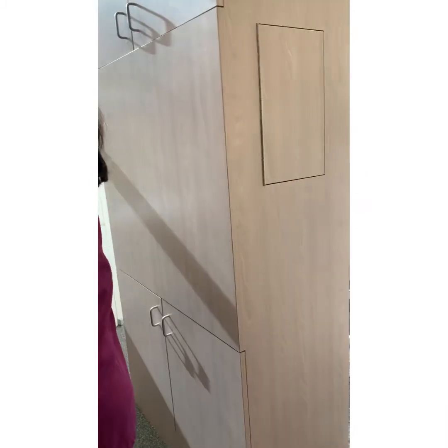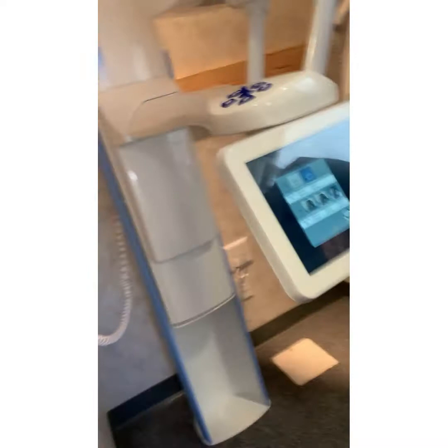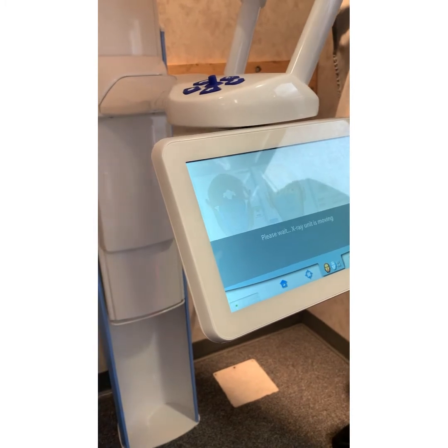So we're just out of the way about where her chin's going to be. Have them hold it just like we were doing. Exactly right. First, we're going to choose key, remember? And then we're going to rotate this and choose that. Ta-da. Now you have your 10 by 10. You see it right there. Now, once we choose this button here, it'll do this little dance.